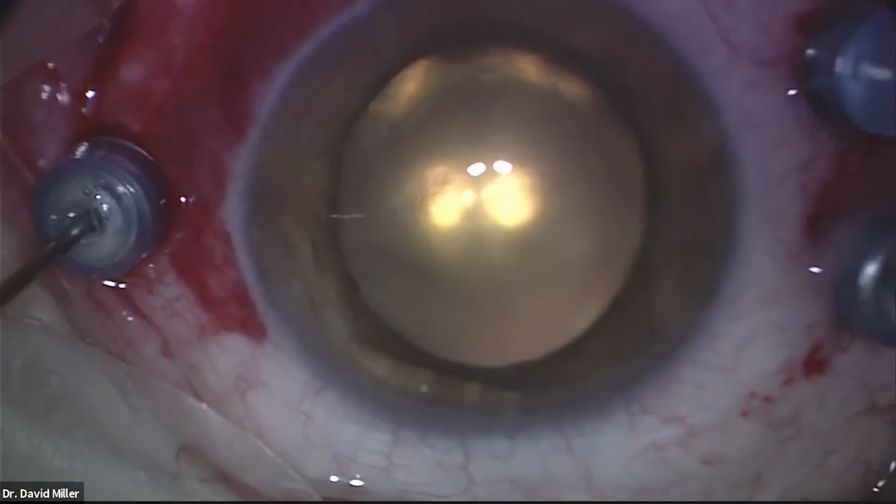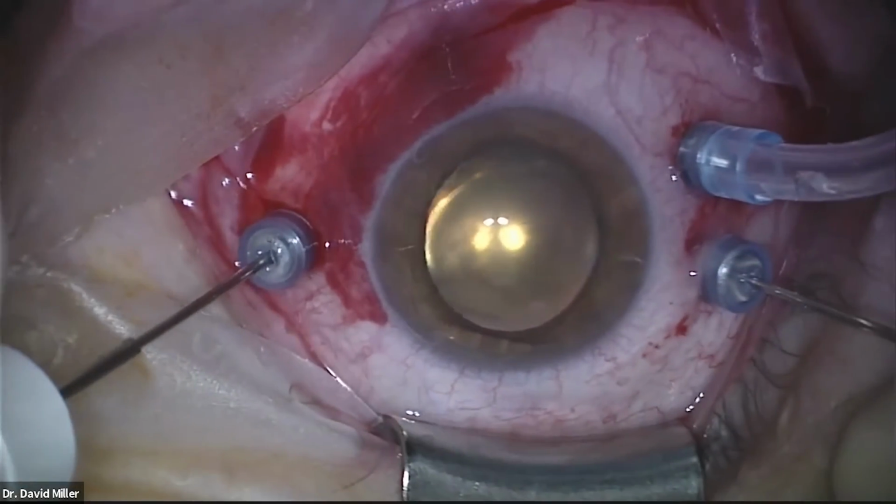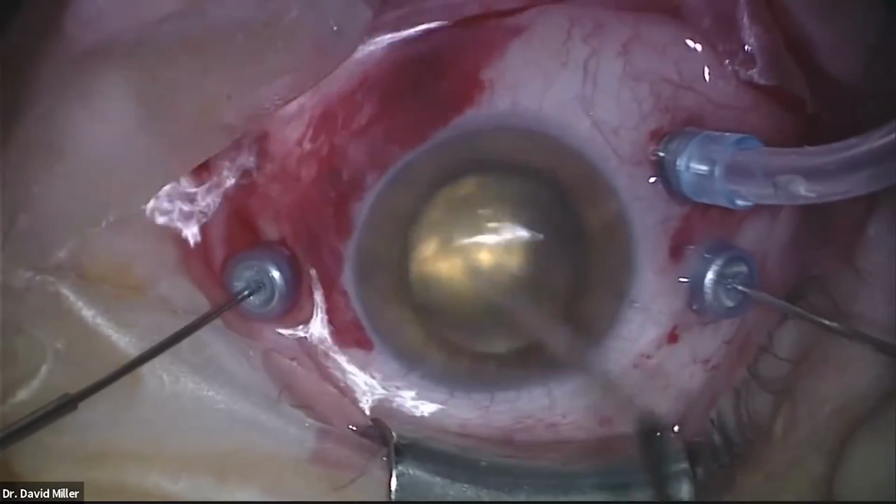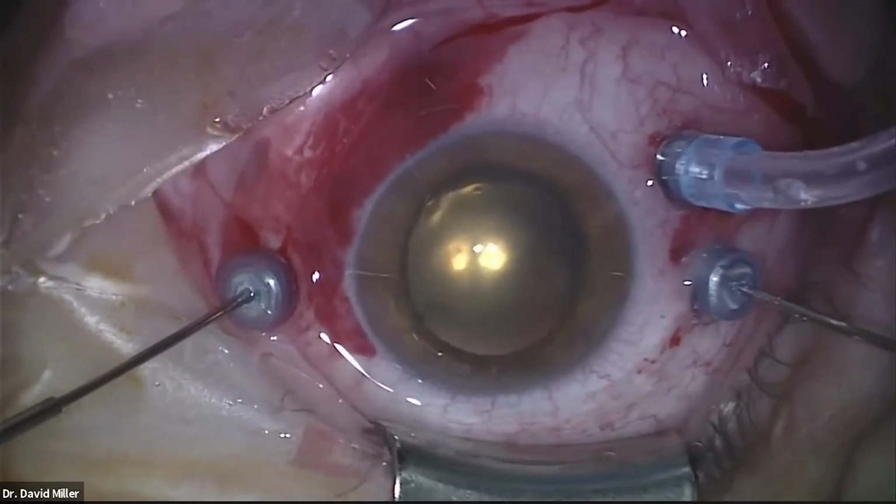Or losing our view a little bit. Let's see if it looks better under here. Cornea is a little, is it wet? We're lubricated there? Looks pretty good. So there you go. We're going to splash the cornea a little bit. Oh, that worked. We'll dry again at the retinotomy site. Remove the subretinal fluid.